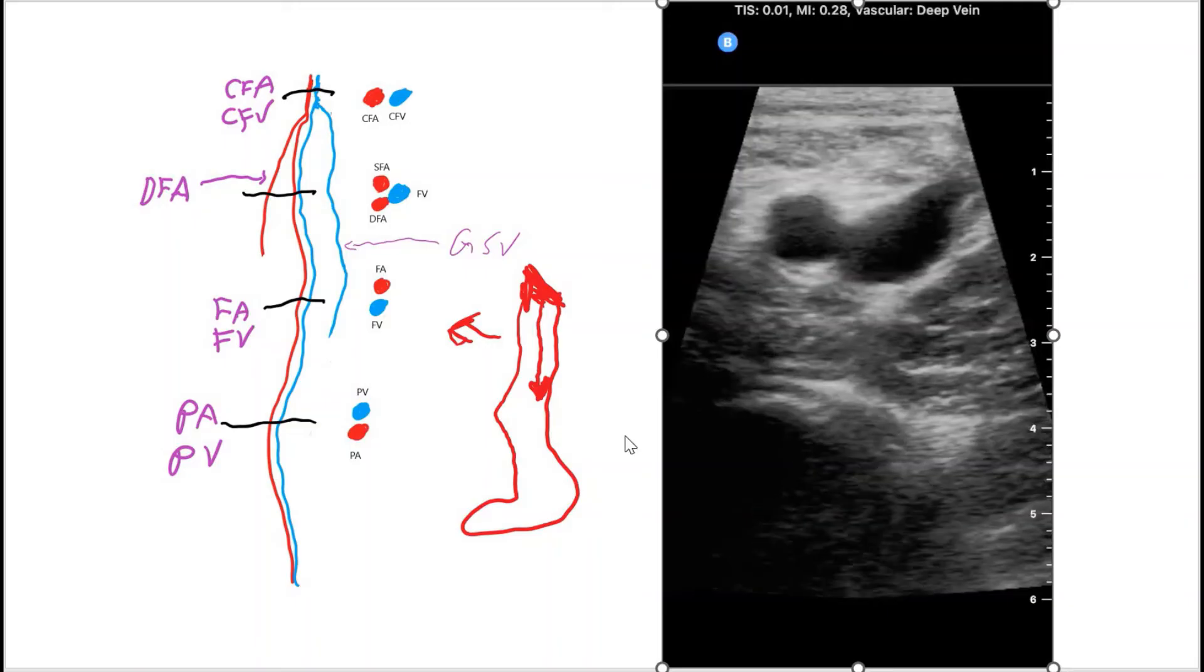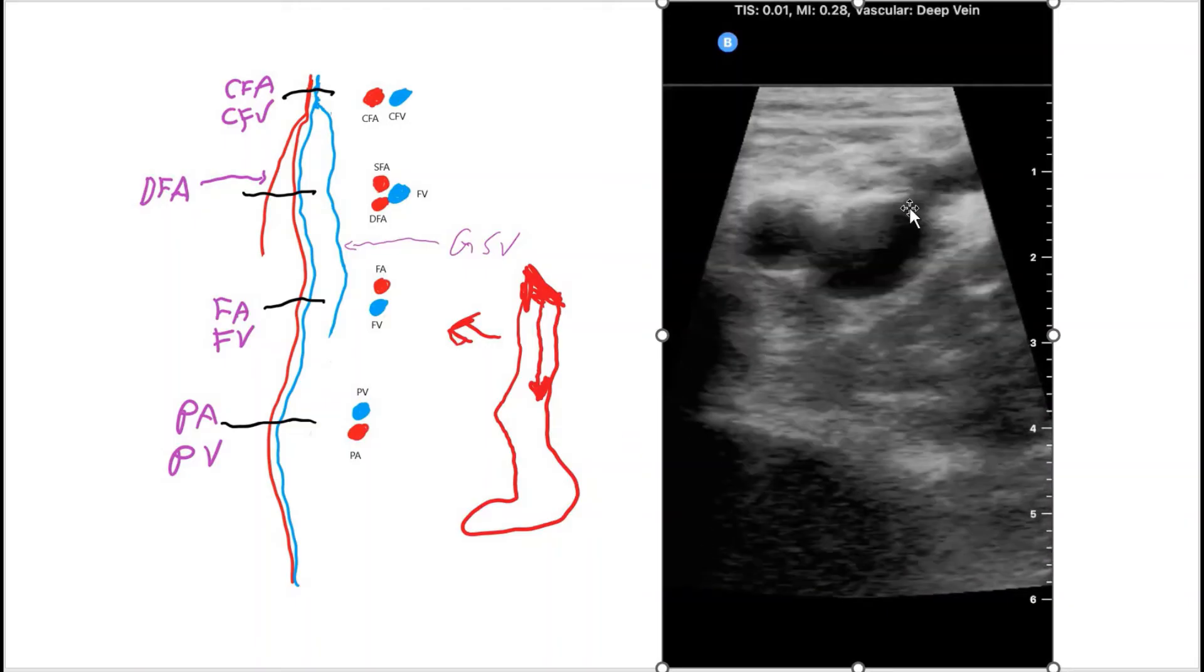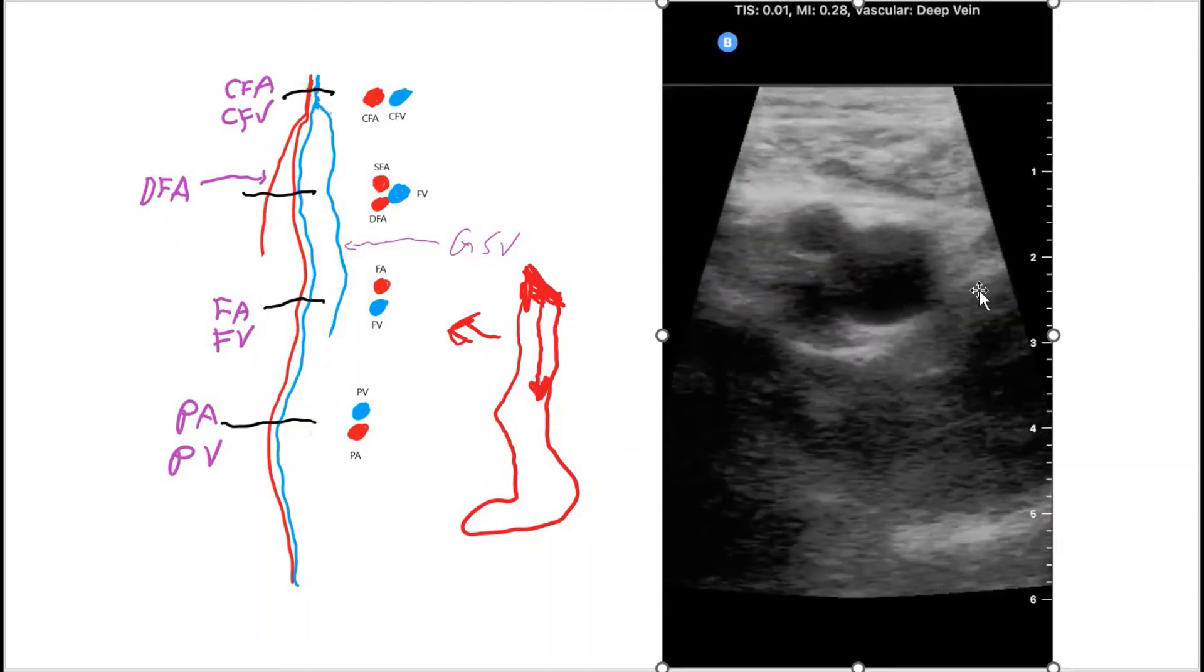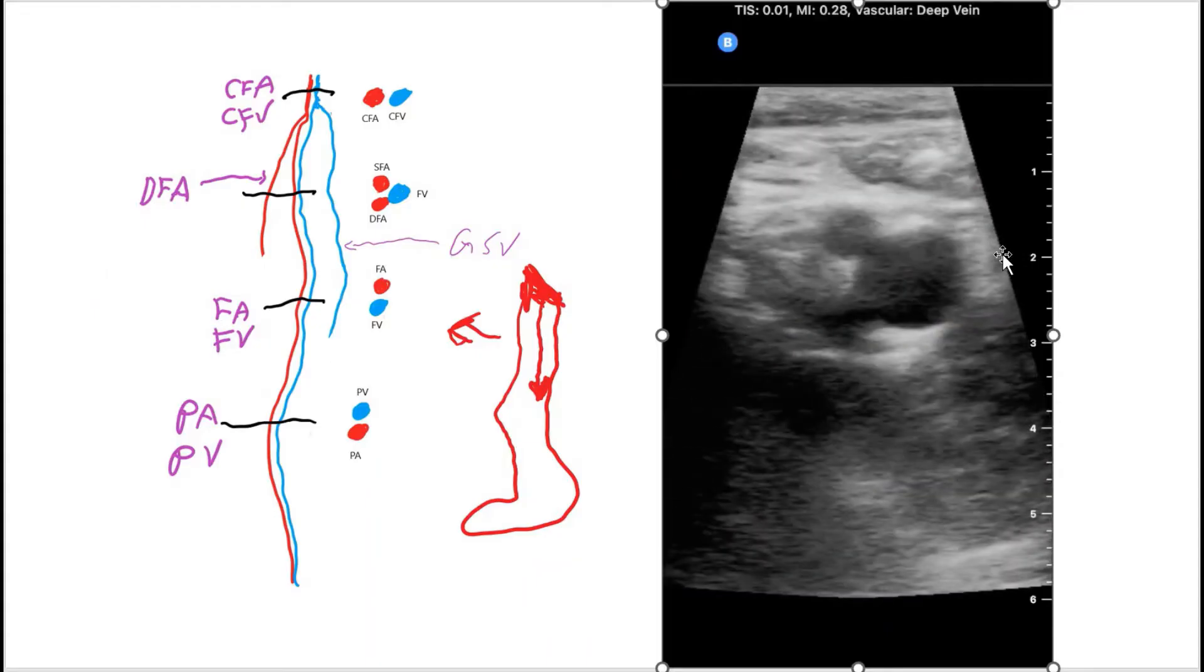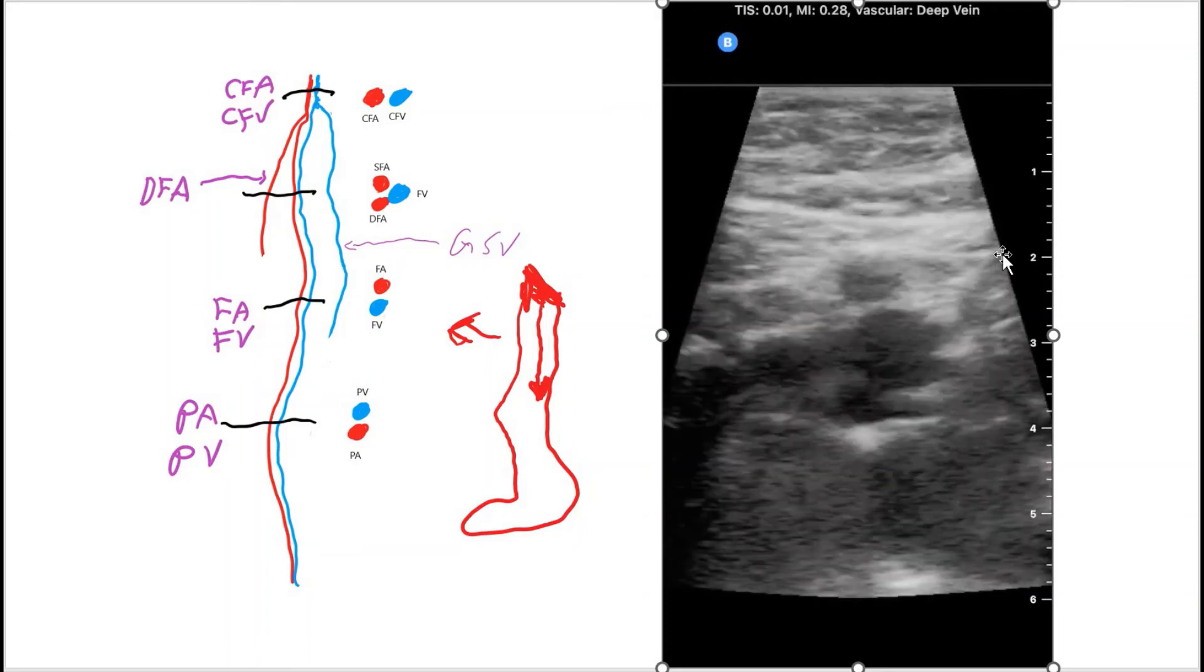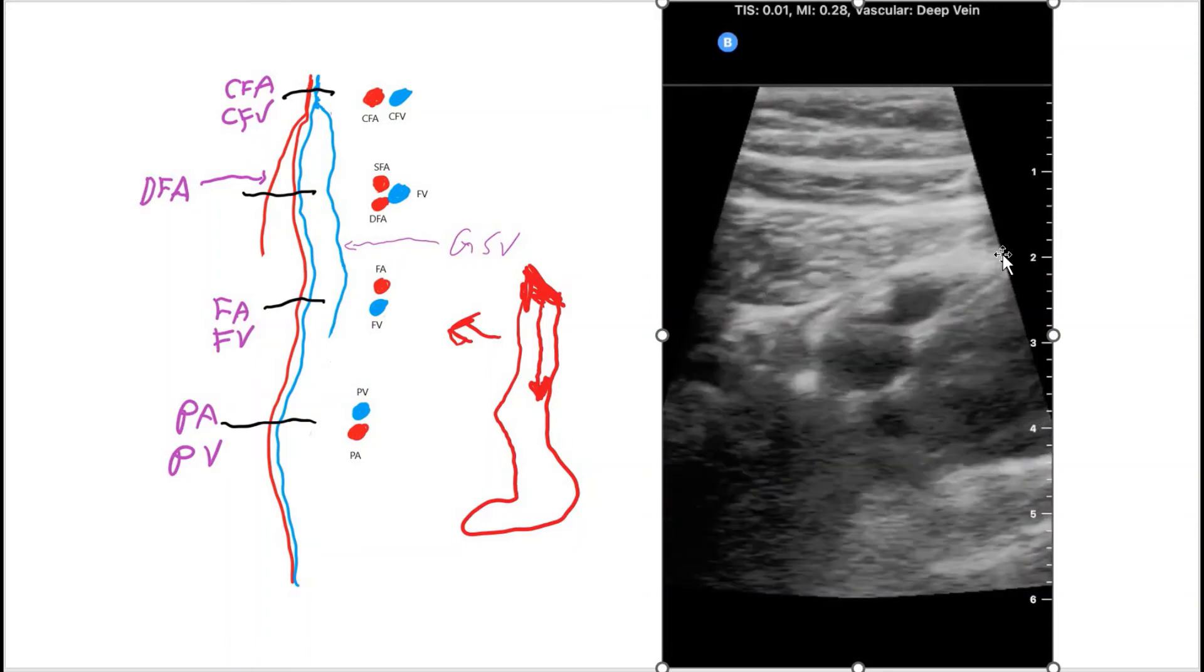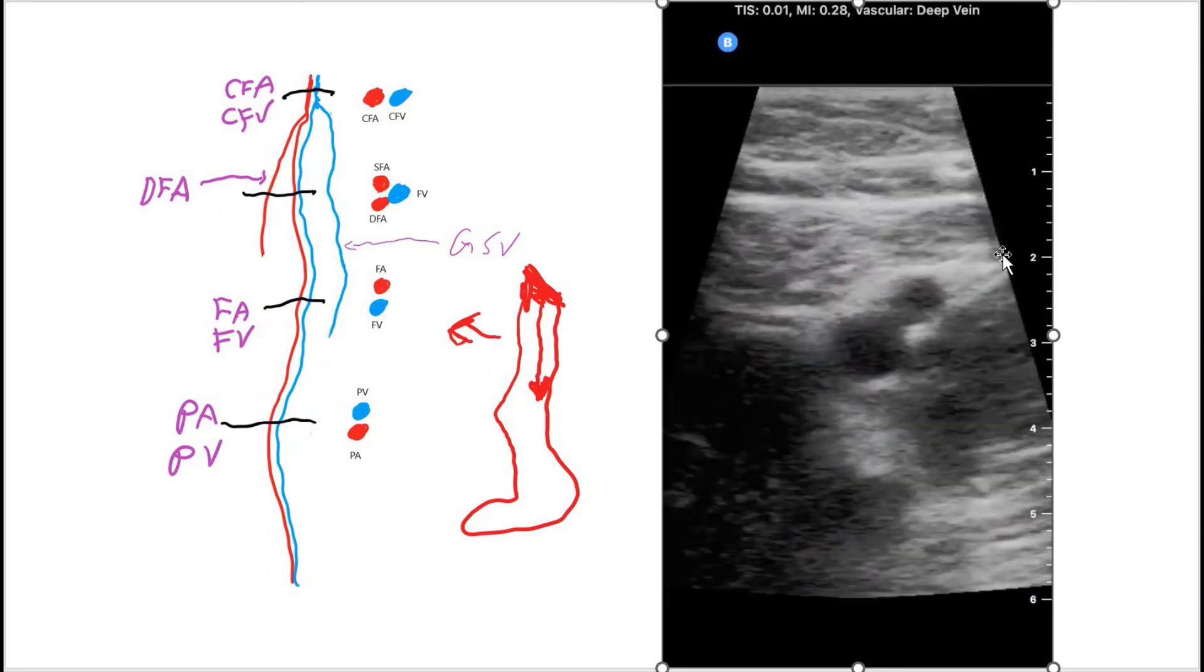And here's a video. So that's the inguinal area. Compress completely. And here you see the Mickey Mouse sign. The vein collapses when you compress. And scan down a little bit more. And you compress. Completely collapses.